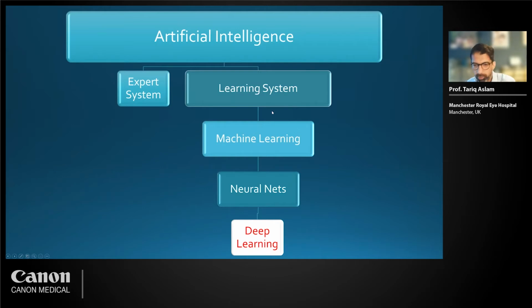Now, there are different approaches to this. We could take a machine learning approach. We want to do something with the images that goes beyond just clinical assessment. Sometimes, especially the deep learning systems, and certainly in the machine learning area, take a lot of images, maybe thousands or so of images, which we haven't been able to access. We've only got access to less than 100 images.